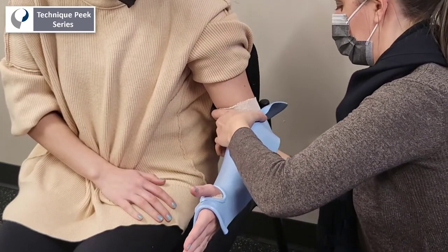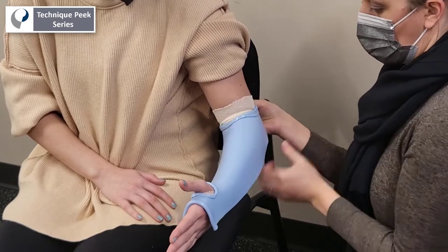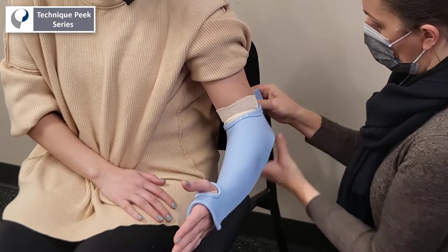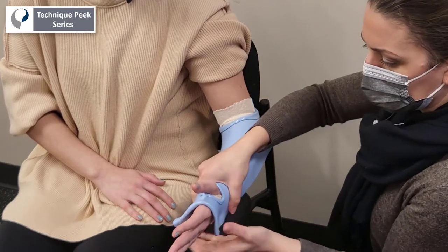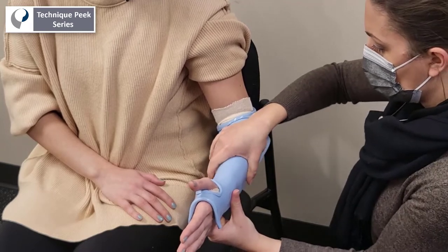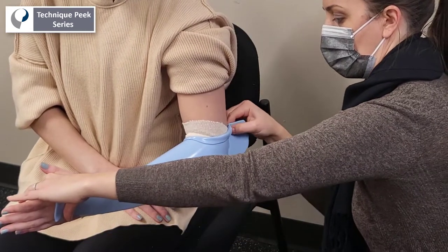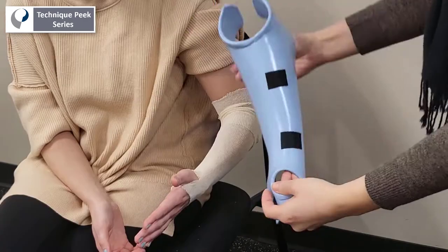Then secure the wings alongside the epicondyles by pinching the excess material together posterior to the elbow. You can pop open the wings and cut away this extra material after the splint has begun to harden. Continue to gently conform the material to the length of the patient's forearm. Here you can see that technique of pinching the wings behind the elbow.